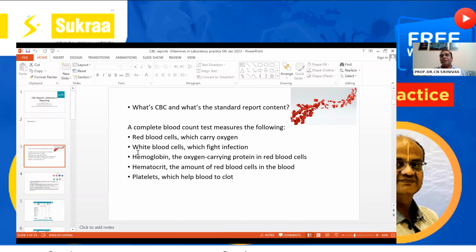So CBC, as Sir said, is a very common word, and I thought first let us see it in layman's terms, because maybe one or two people are not really into the lab field. What does a complete blood count measure? It measures the red blood cells, white blood cells, hemoglobin, hematocrit, and platelets. A little bit of biology: RBCs carry oxygen, white blood cells fight infection, hemoglobin is the oxygen-carrying protein, hematocrit is the amount of red blood cells in the blood, and platelets help the blood to clot.